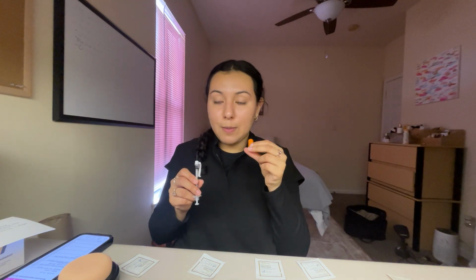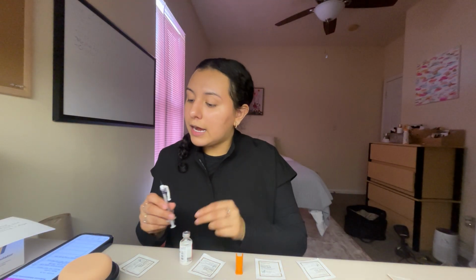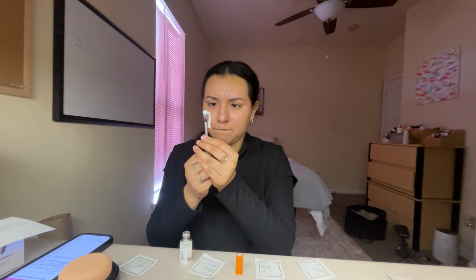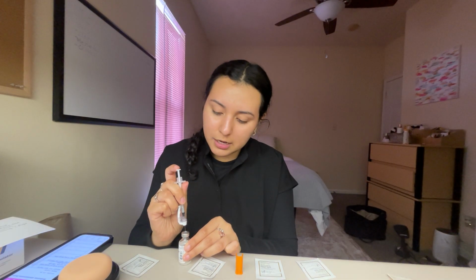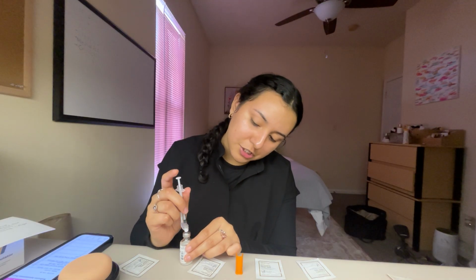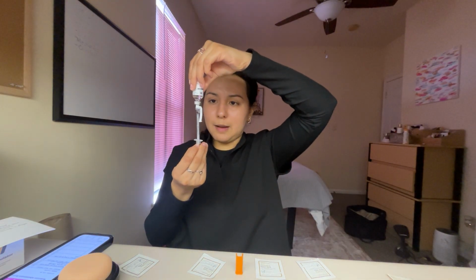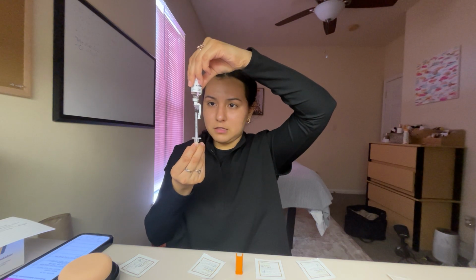So I'm going to make sure that I remove the cap. I'm going to place the cap laying face up. And then it says for insulin, I have 6 units to give. So I'm going to aspirate 6 units. Alright, and then I'm going to inject my syringe into my vial. I'm going to make sure that my solution is not touching the needle. I'm going to inject the air. Then I'm going to invert, and I'm going to prepare 6 units of insulin.